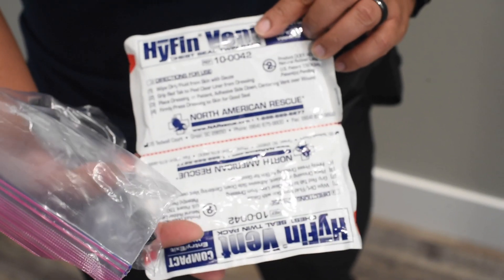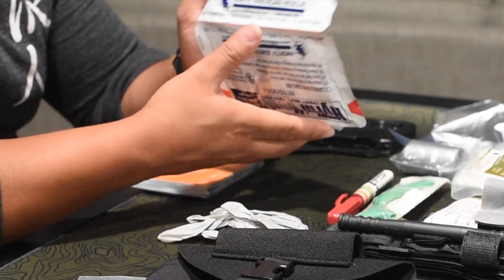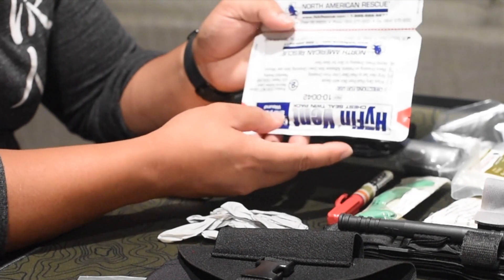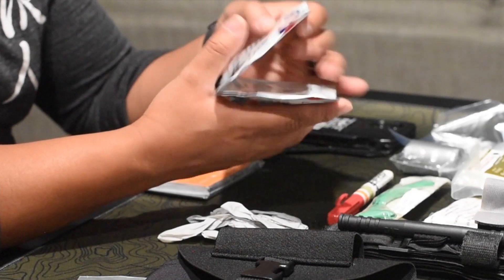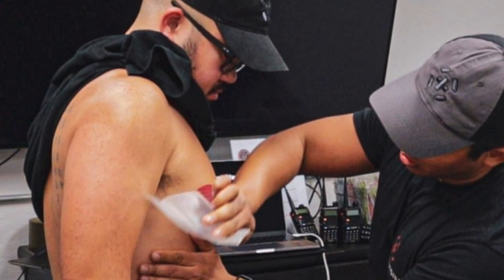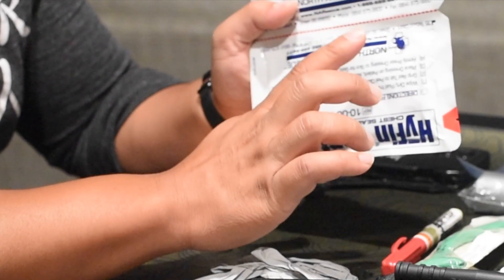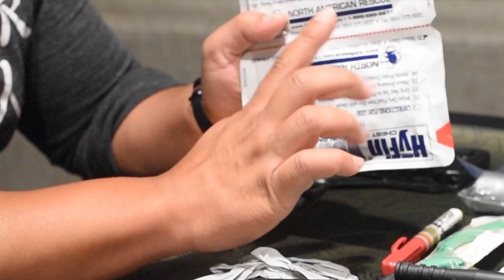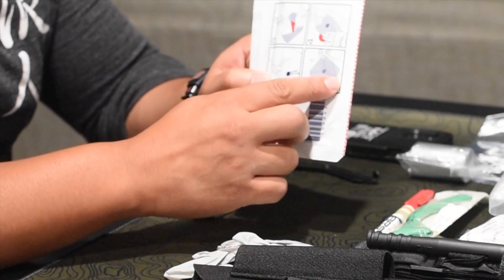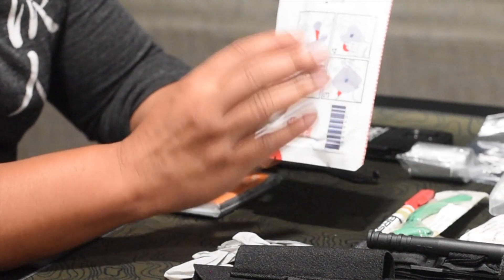Hyfin Vented Chest Seal — it's compact, it's a two-pack, and fits really well in something of this size. They do have bigger sizes and there are other versions of chest seals. I primarily run Hyfin chest seals because I'm very familiar with them. For sucking chest wounds in the thoracic region, first put your hand on the hole to prevent more air from getting in, open this up — there's a seal plus a wipe — wipe the blood off and slap these on to prevent more air from entering the pleural space. There are three vented areas to allow excess air and blood to ooze out while preventing more air from getting in.